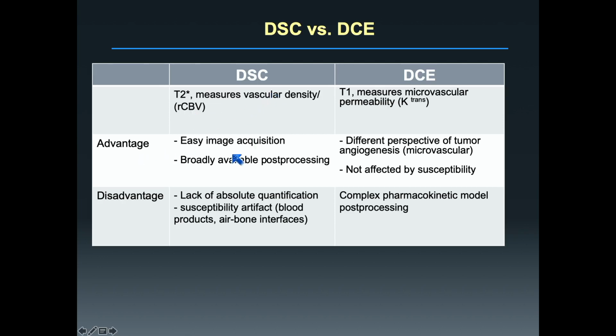The advantage of DSC is that it's easy image acquisition. It's about a 1.5 minute acquisition. It's broadly available, and post-processing is relatively easy. And again, there are even software packages free online that you can actually use to process this data set.